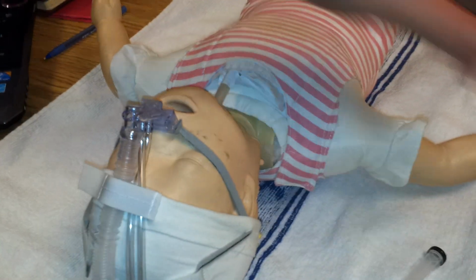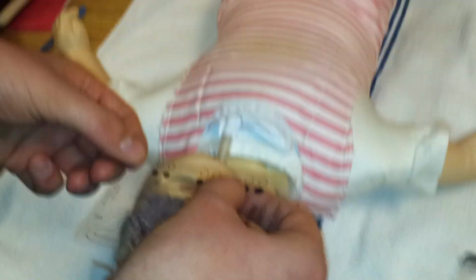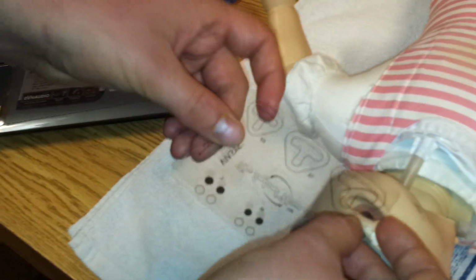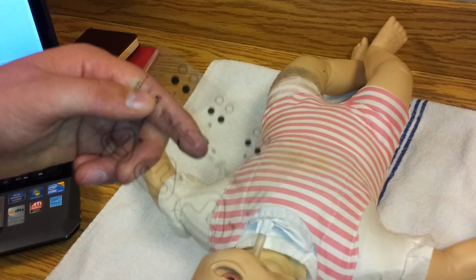So to size the prongs or mask, you're basically going to use this little sheet right here. The prongs, you're basically going to match it up with the baby's nares, and you want it to cover almost the entire naris. Or the mask, you match it up with the face, and it tells you exactly which one you should use. Small, medium, large, extra small, extra large, extra extra large. Usually most centers will switch between these every day, just so that you don't hurt the baby's nose or face.